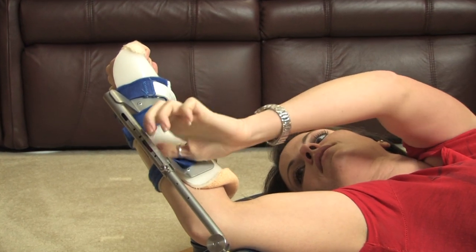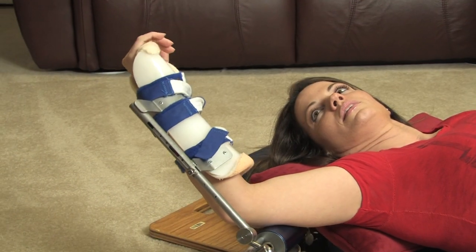My sales consultant met me, showed me the Dynasplint, gave me the instructions, and she was very empathetic to my injury.